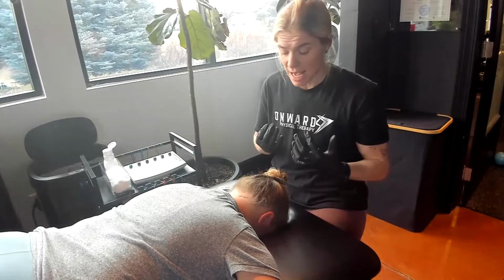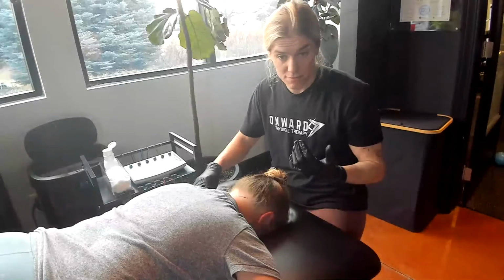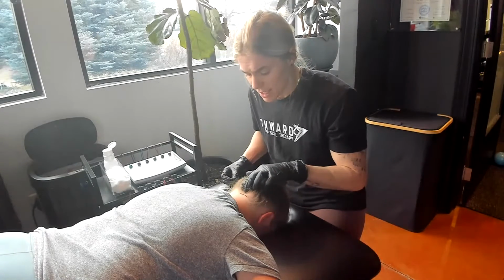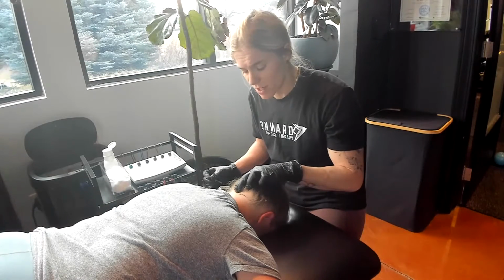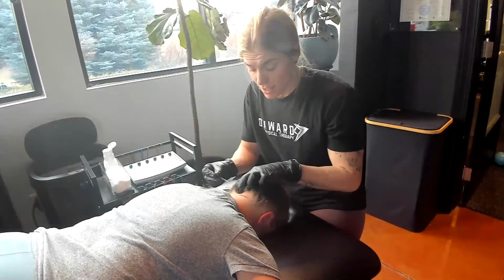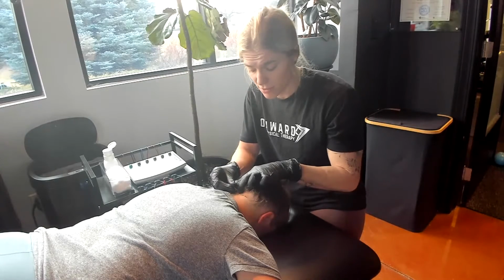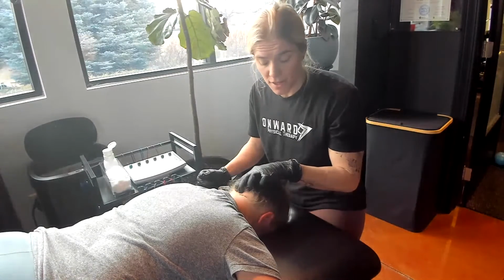For treatment purposes, I would be doing bilaterally, and we can walk through that if, let's do it. Why not? Let's do it again. So again, we're going to find EOP, drop just distal to that superior nuchal line, stepping 1 finger breadth laterally. That's going to be our upper trap insertion. Needle direction is towards the eyeball, perpendicular with the occiput here. 2-finger digital compression, firm compression, creating a small window between our 2 fingers, firm tap, advancing the needle to a bony backdrop on the occiput.